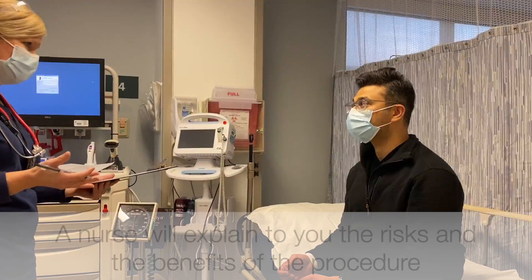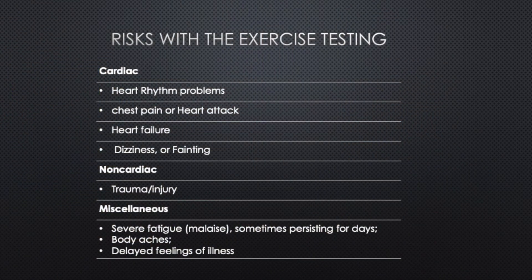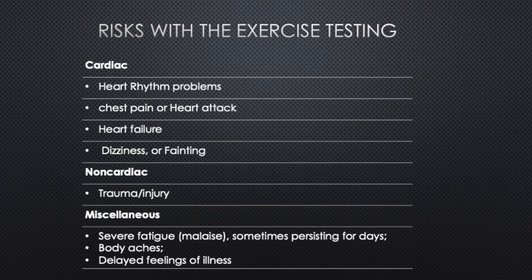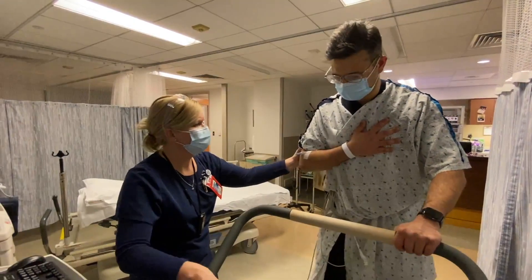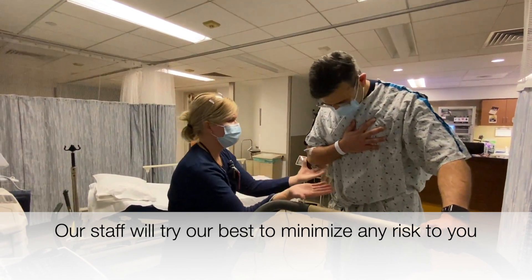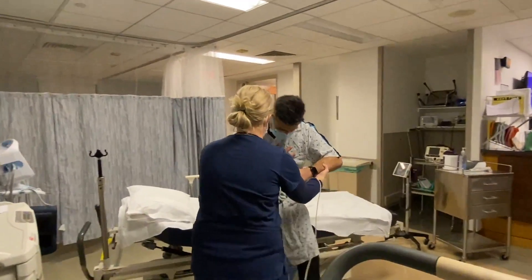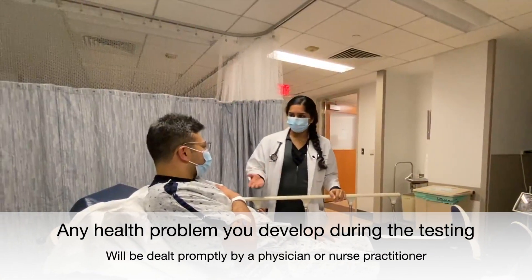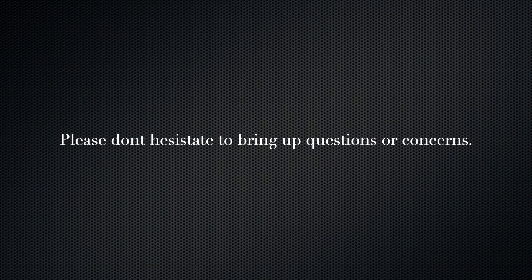Before we start, the nurse will explain the risks and benefits of the test. This test is done routinely, but as with every test, there are potential risks. The most common risk is chest pain. Other risks include dizziness, nausea, or rarely an allergic reaction to medications. The test can cause a heart attack. Although this is unlikely to happen, it's still a risk. Should anything occur, we have staff and medications to treat you. If you have any further questions, please don't hesitate to ask the nurses or the physicians in the stress lab.